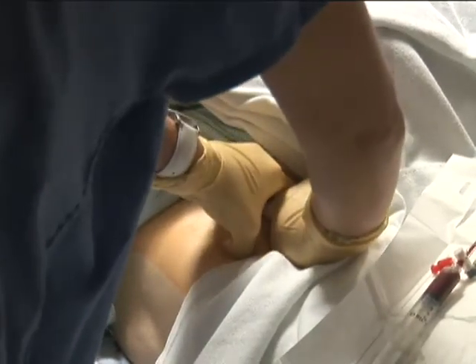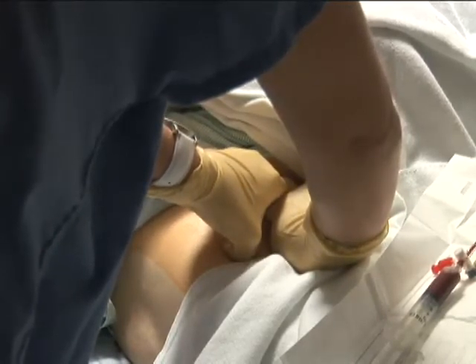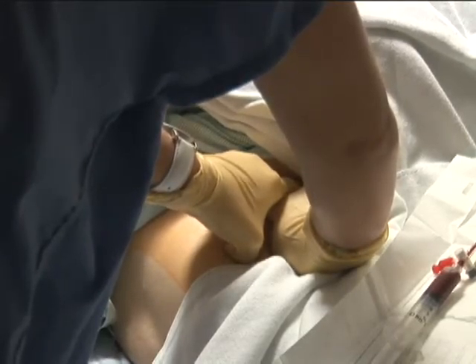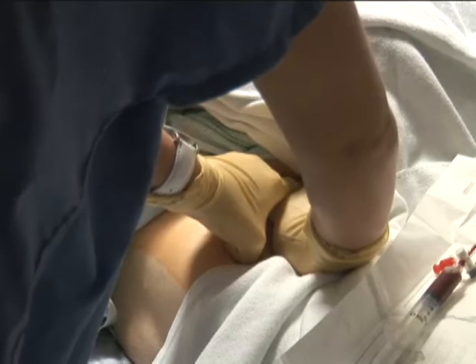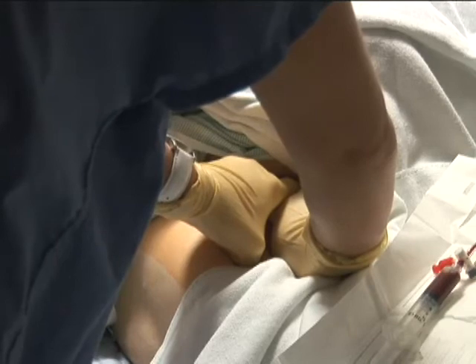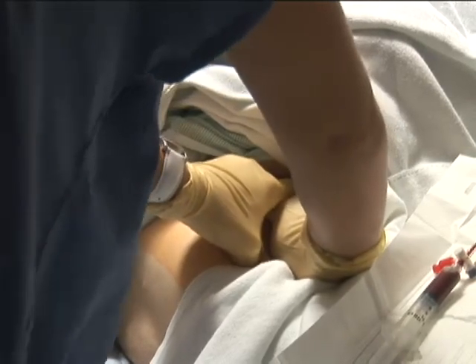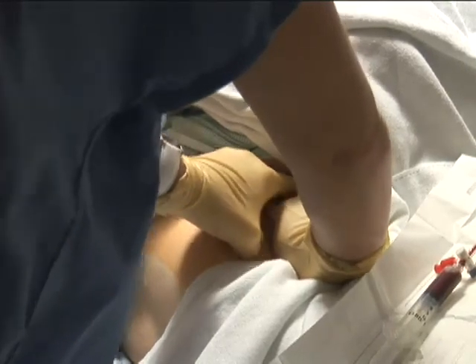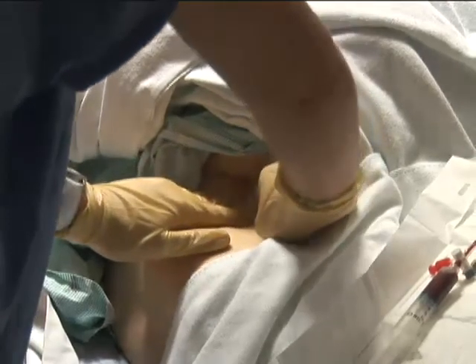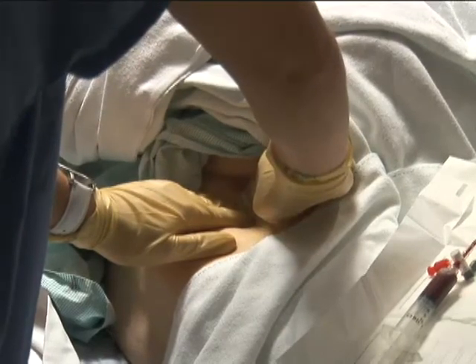Care must be taken, however, not to hold such firm pressure that the distal pulses are not detectable, as doing so increases the risks of lower extremity vascular complications such as thrombosis. By rule, the duration of manual pressure is 2 minutes per sheath French size. So for a 5 French sheath, approximately 10 minutes of manual pressure is held before checking for adequate hemostasis. If bleeding is still observed after the allotted time, additional pressure should be held until hemostasis is fully achieved.